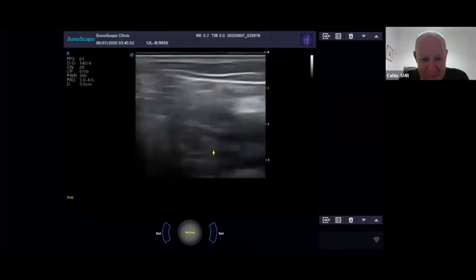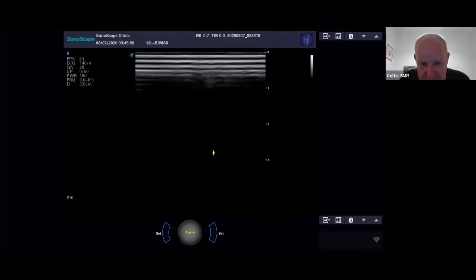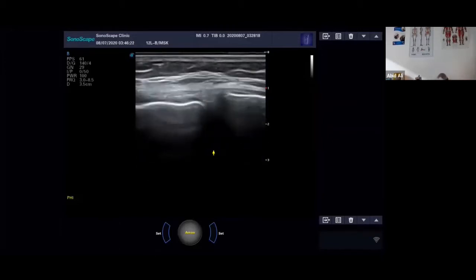Okay, now then, we've got a question and a couple of requests here, so don't get comfortable just yet. So one question from Elaine: how far would the meniscus protrude before you diagnose acute injury, or is the presence of inflammation the determining factor? So how far would the meniscus protrude before you diagnose acute injury? I think she's asking if there'd be some vascularity or any other features around it.